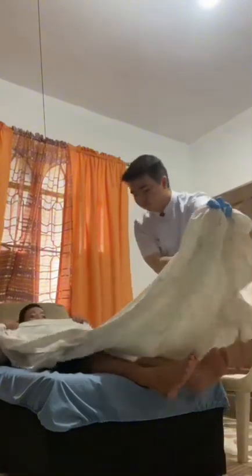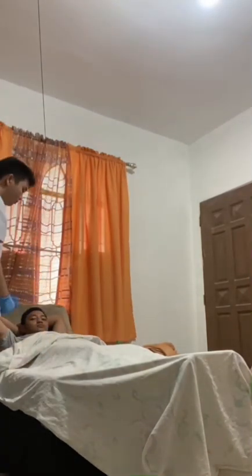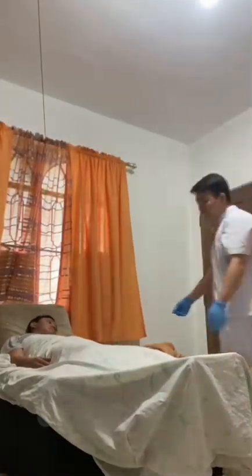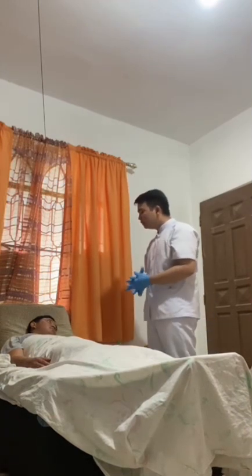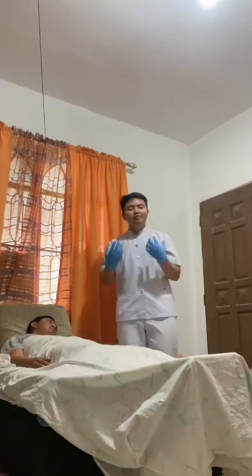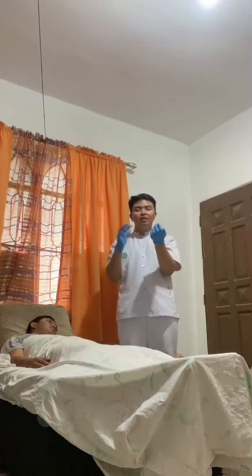Okay. Go back, sir, please. Sir, do you feel comfortable? Yes. So, after doing the procedure, I'm going to remove my gloves, perform hand hygiene, and document and report.